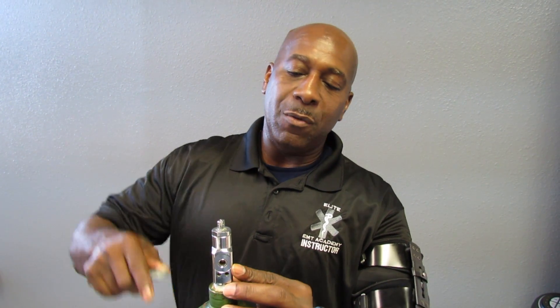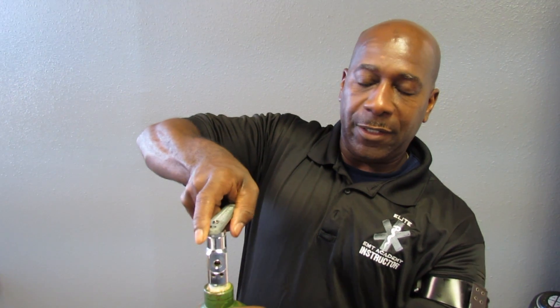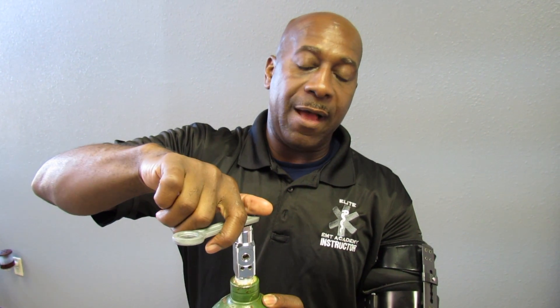To clear the valves of the oxygen tank of debris, you want to crank the oxygen tank open and clear it one time. Make sure when opening the valve, you point it away from anyone and yourself.